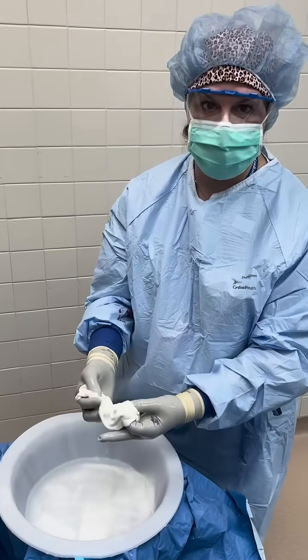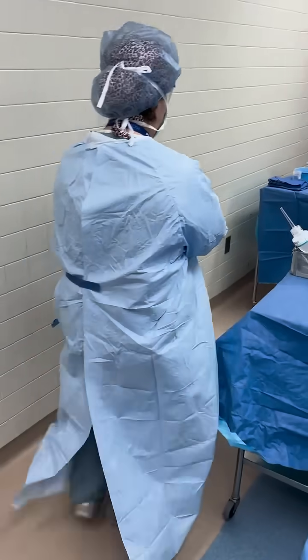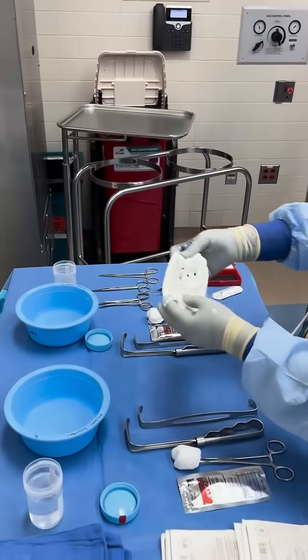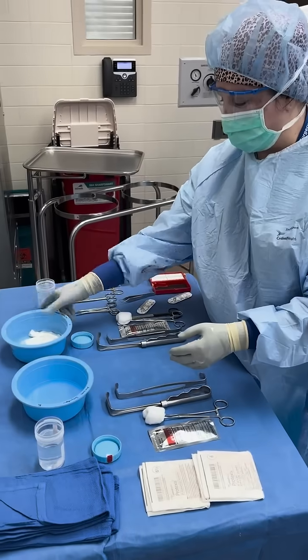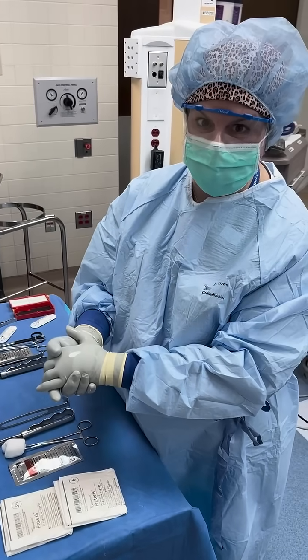After doing that, I'll place it in the triple antibiotic solution. These bowls have triple antibiotic solution in them, and we'll let it sit there and soak for a little bit until I finish preparing the pocket.